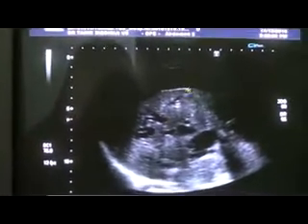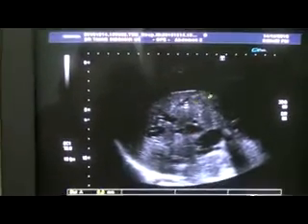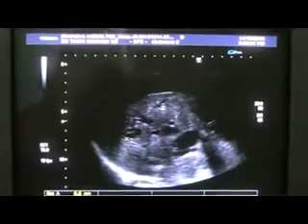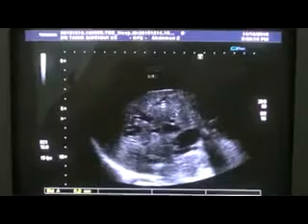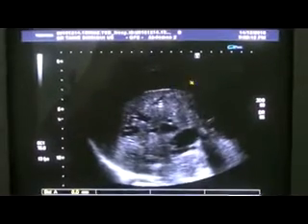Ultrasound of a 55-year-old female. We are seeing a cirrhotic liver. The outer surface of the liver is irregular. It's coarse, and there are tubular structures seen within the cirrhotic liver — all of these are the dilated intrahepatic bile ducts seen in the right lobe of the liver. The liver is surrounded by ascitic fluid.